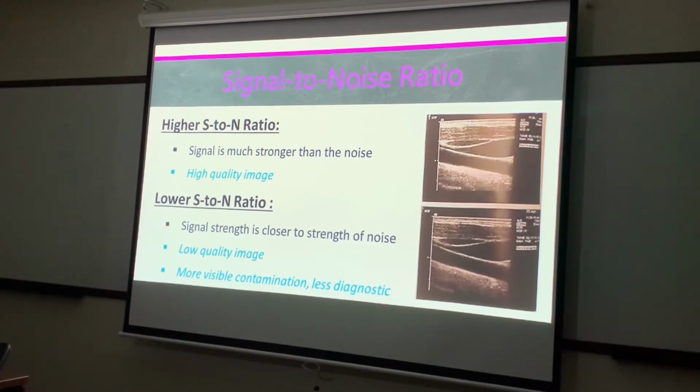Which one is most desirable on a signal-to-noise ratio? The higher signal to noise ratio is more desired because we do want more signal than noise. Say when we're looking at the liver, because I'm comparing it to contrast, I really want to be able to see the gray shades in my liver, but I still don't want a whole bunch of noise obscuring it. Bowels create a whole bunch of noise. That peristalsis, that air in the bowels, creates noise on the image, making it less visible for us to see what we need beyond those bowels. So a high signal to noise ratio is more desirable.